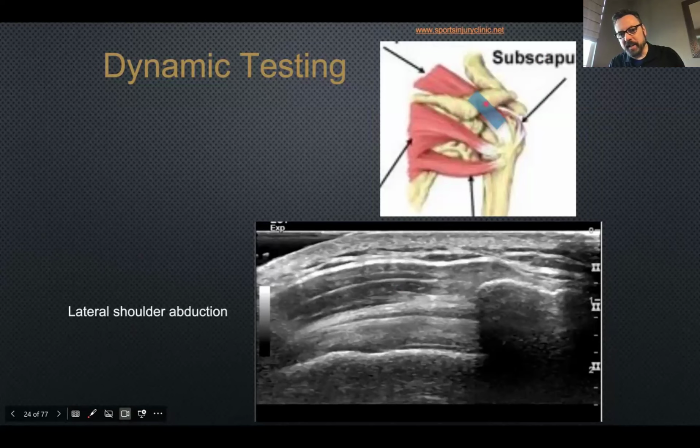One half of it is on the acromion process, and the rest of it is showing you that supraspinatus tendon. Down here at the scan, this is the top of the acromion process. We don't see anything underneath it because the ultrasound waves are blocked by the acromion. But we are able to see the edge of the acromion process, and then this is the supraspinatus tendon.